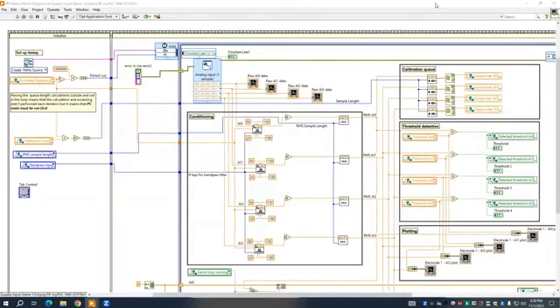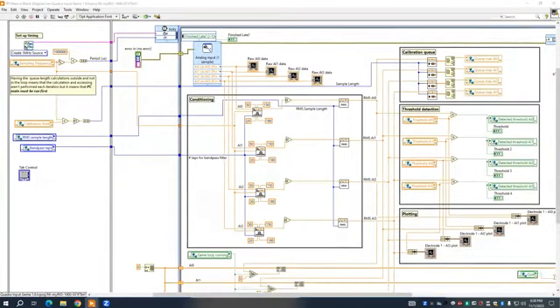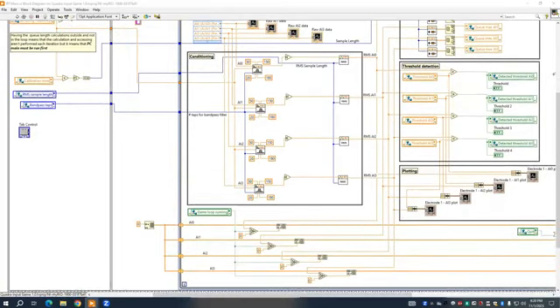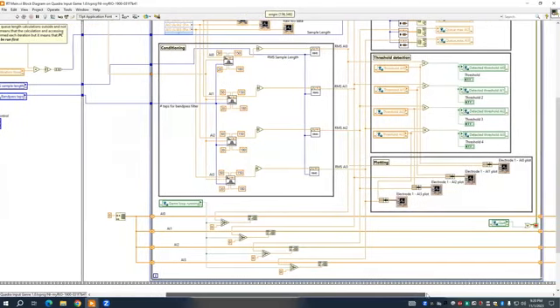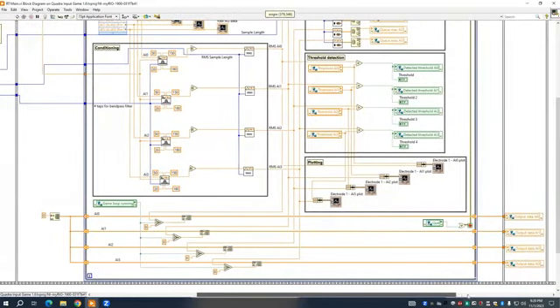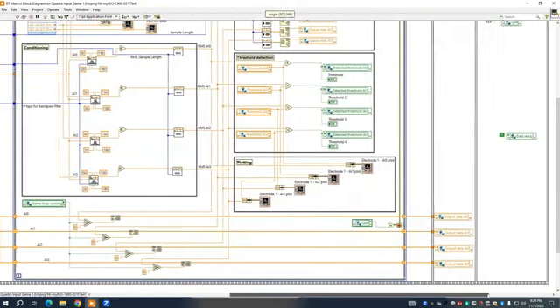RT-Main is the software that runs on the myRIO. Its main purpose is to sample and process the EMG signal. The frequency of a raw EMG signal ranges from 6 to 500 Hz. However, the majority of the signal's power lies between 20 and 150 Hz. Thus, in order to process the signal in real time while avoiding aliasing effects, our device samples each input channel at 400 Hz.